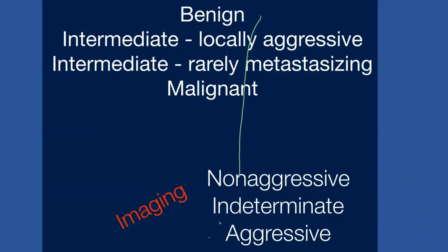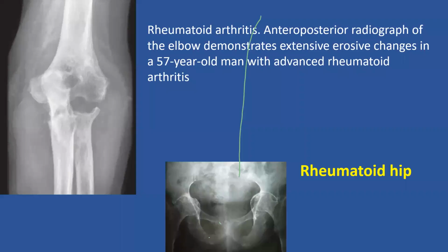When you come to classification of tumors, I'm not going to go further because there are lectures to come on tumors, and you have the latent, you have the active, you have the aggressive lesions. You have to know these by plain X-ray. Don't forget that other lesions can occur besides tumors.